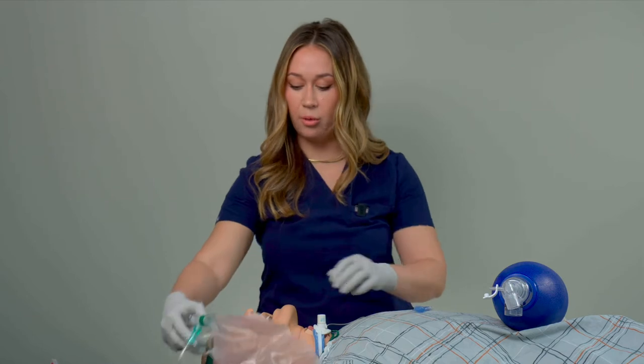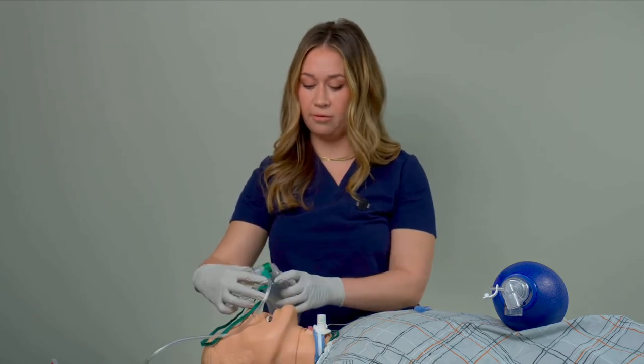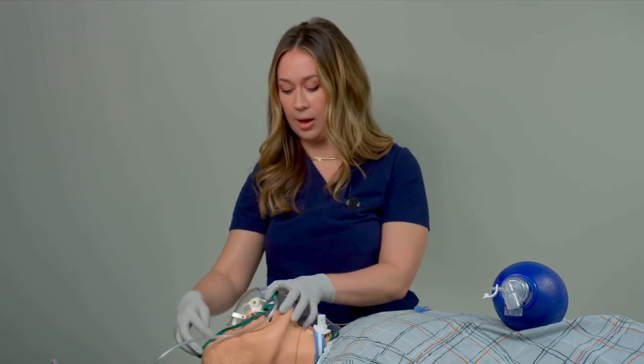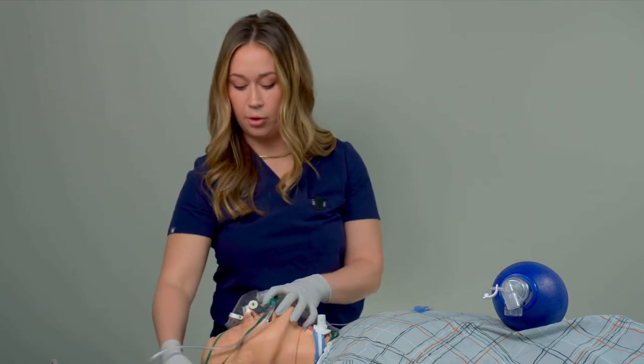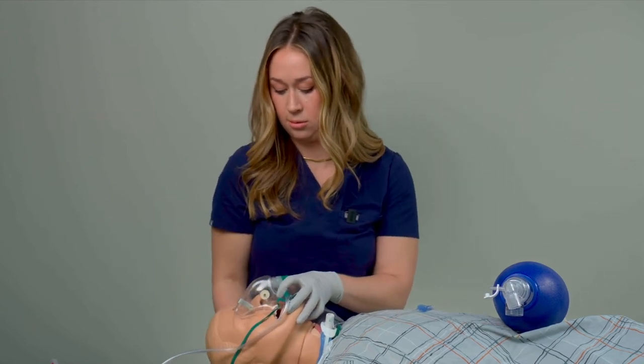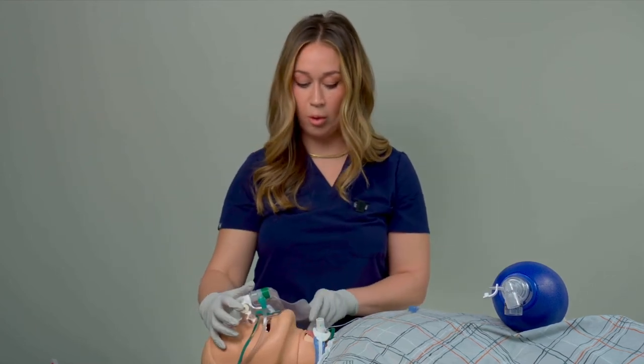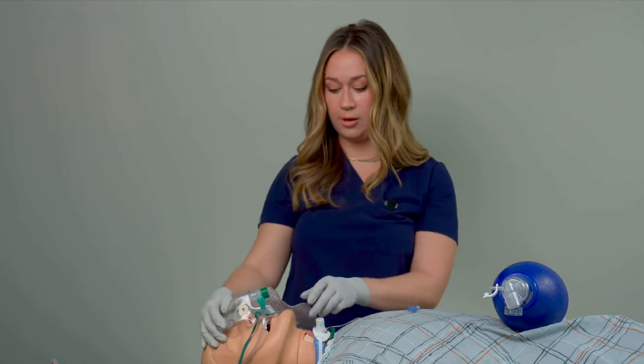Next you're going to want to optimize the oxygenation of the patient by putting oxygen on their nose and mouth while you handle what's going on with the trach.